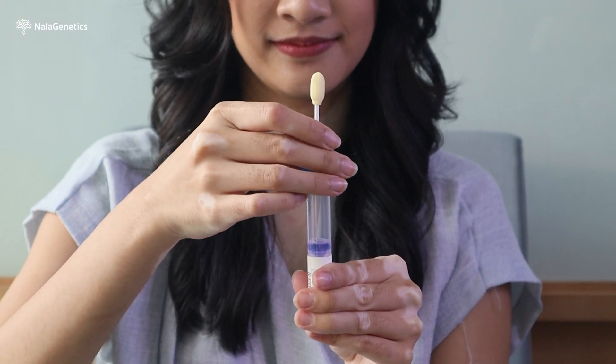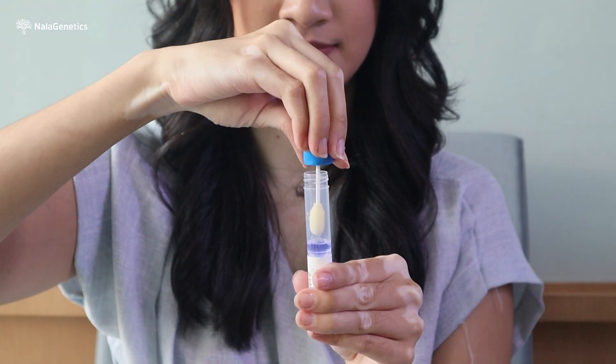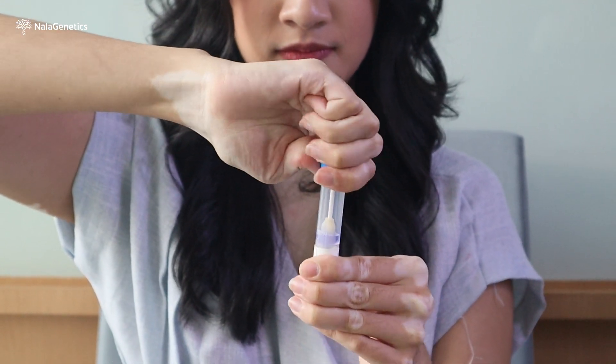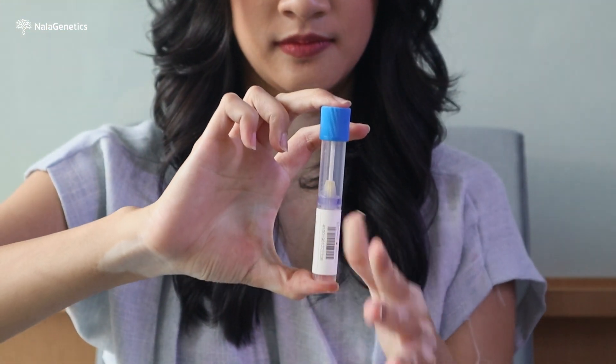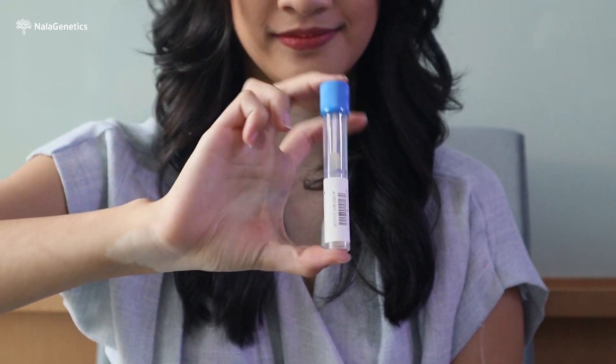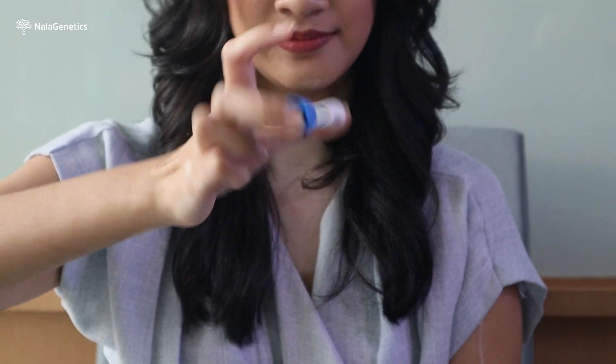Hold the tube upright to prevent the liquid in the tube from spilling. Unscrew the blue cap from the tube without touching the swab, then turn the cap upside down and insert it into the tube. Screw the cap closed tightly. Flip the tube 15 to 20 times to ensure the liquid is thoroughly mixed with your buccal swab.